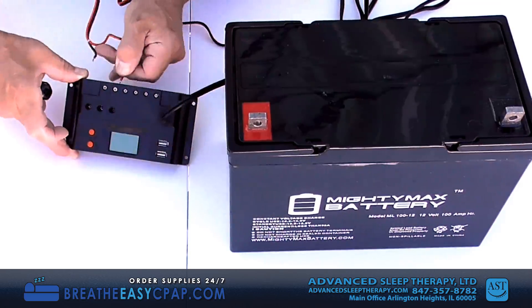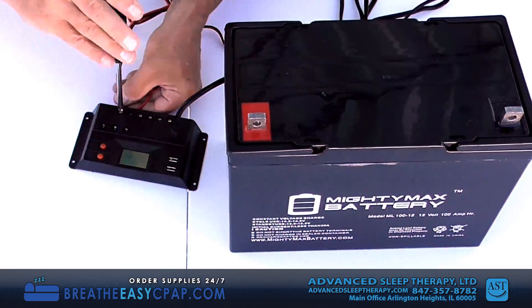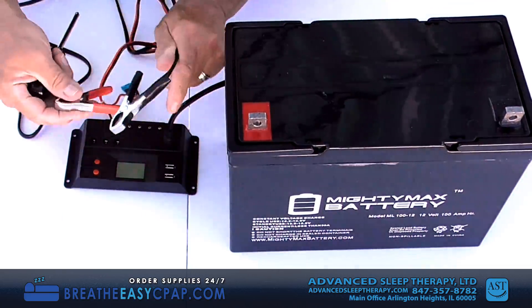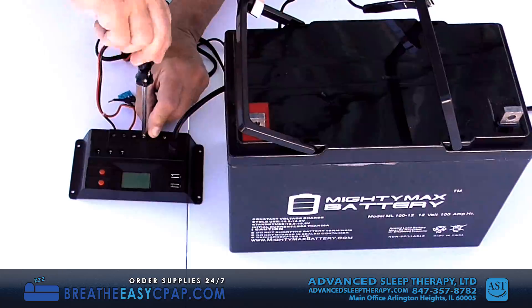Red is positive, black is negative. Attach the battery clamp wires to the controller the same way as before — you will see an icon of a battery on those terminals.